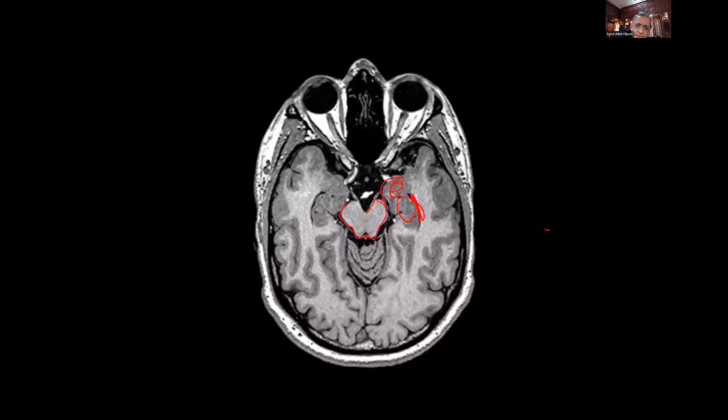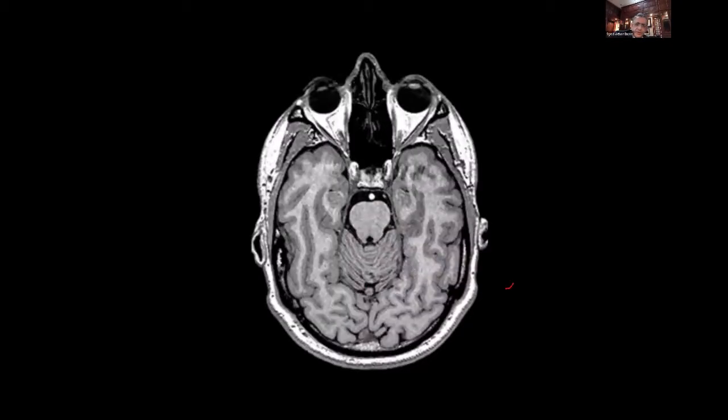This is this patient's midbrain. And I'm running short of time. And intrapeduncular cistern over here, and although you still see the occipital lobe over here, because this is a tentorial notch, you start to see the cerebellar folia over here. Okay, I think we are running short of time. This is the occipital temporal sulcus going like this, occipital temporal sulcus over here, right?